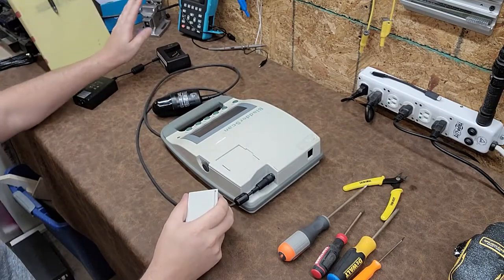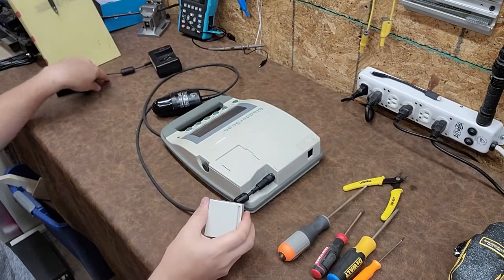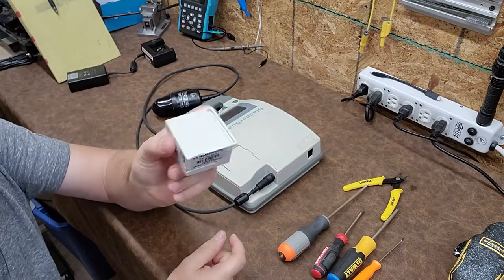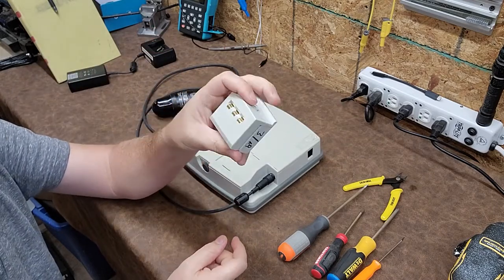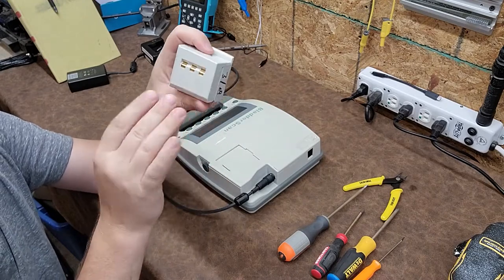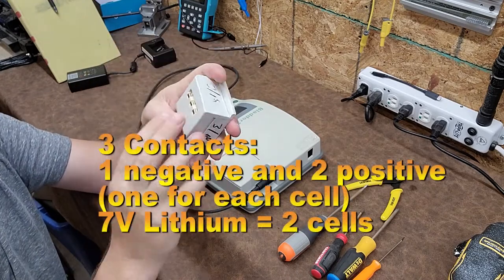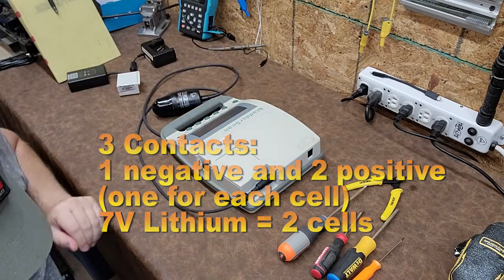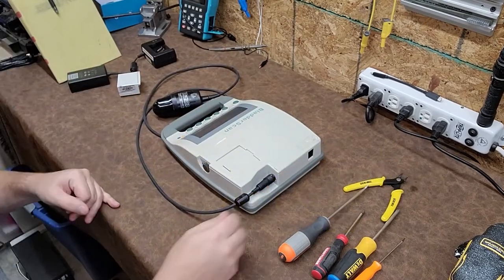You can tell the cable is a little thin, and right here by the strain relief you can already see there's a little bit of a weak point. This one does work but that is a weak point and a point of failure. I might actually open that charger up as well and look at the circuitry inside it. Medical batteries as I said in another video do have some internal monitoring — there are three terminals, which obviously means they're monitoring something in here.